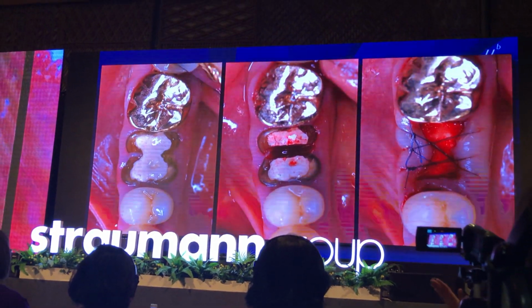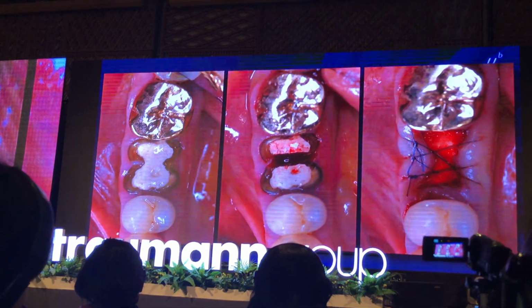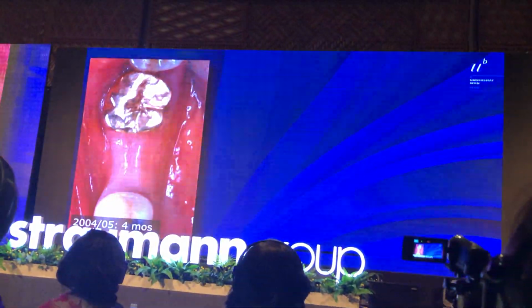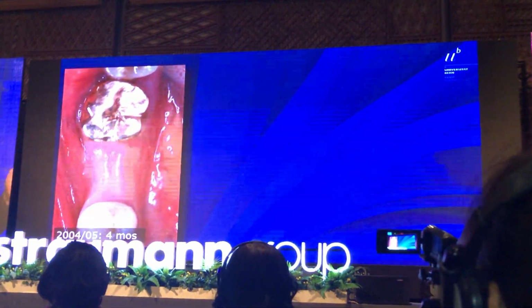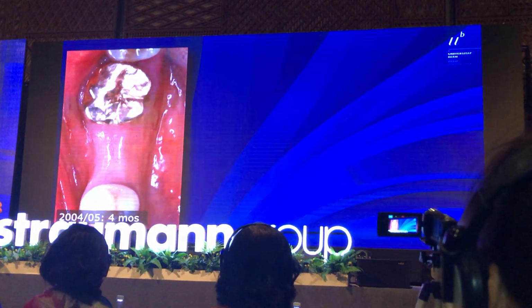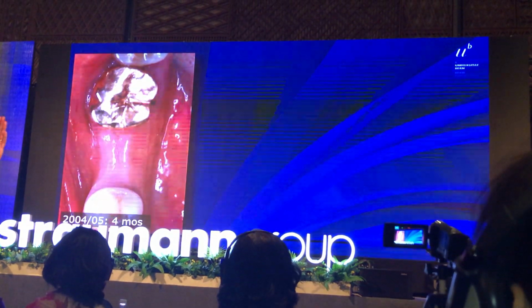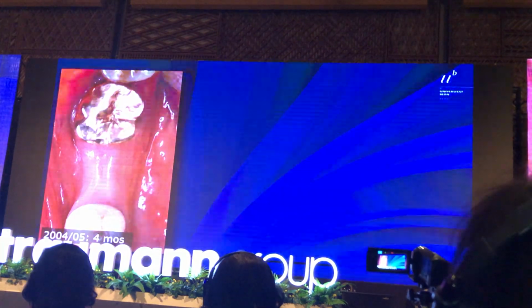Okay. So we put here in this case a collagen plug. Today I will do socket grafting for sure. What I want to show you, this is 4 months post. Little reduction in keratinized tissue. That could not be done flapless here, because when you do flapless in a case like this, you're going to lose the keratinized mucosa on the buccal. That's not a good idea.